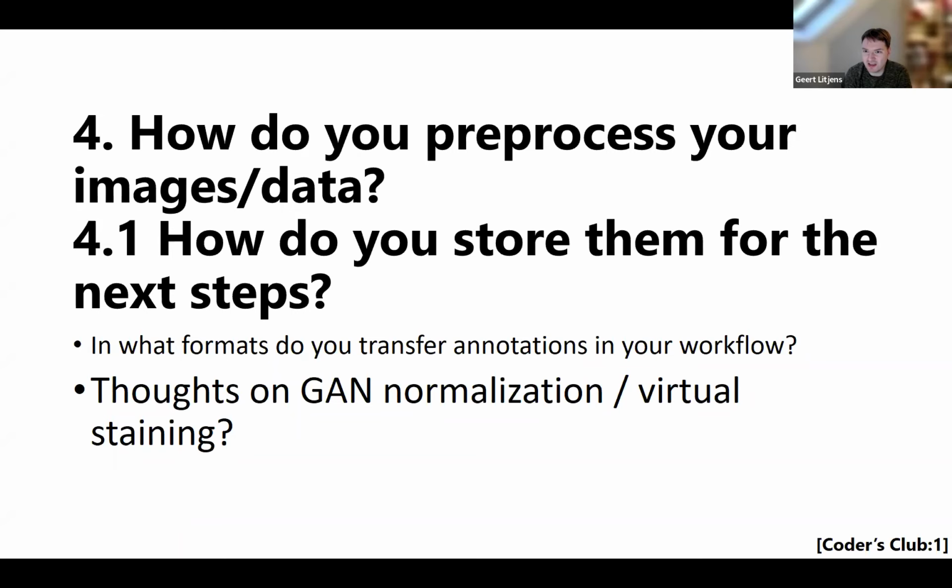So actually the GAN doesn't predict an entirely new image, but it predicts the difference between the original image and the image it should look like. And that, for a large part, eliminated unrealistic artifacts, like that it would hallucinate tissue in the background that was not there. So that helped quite a bit.